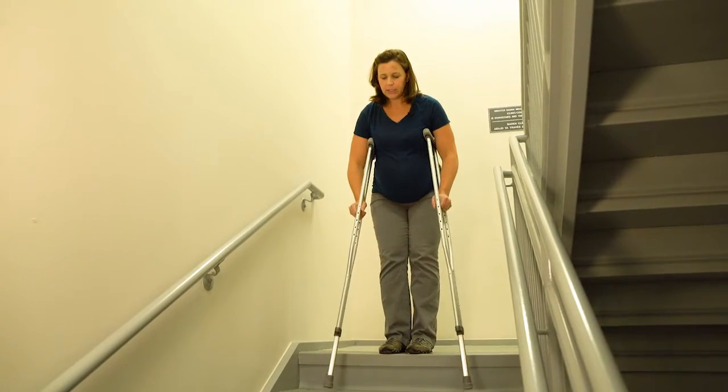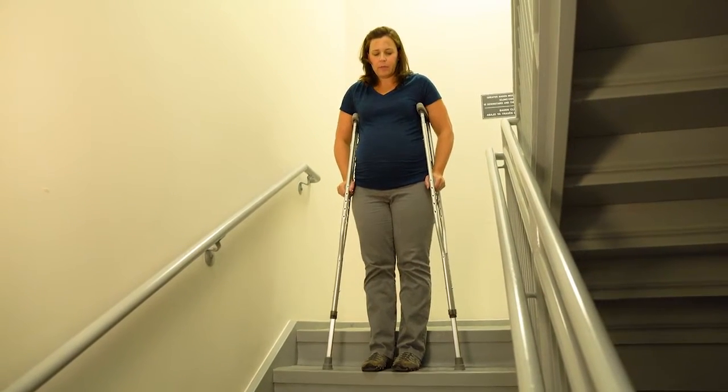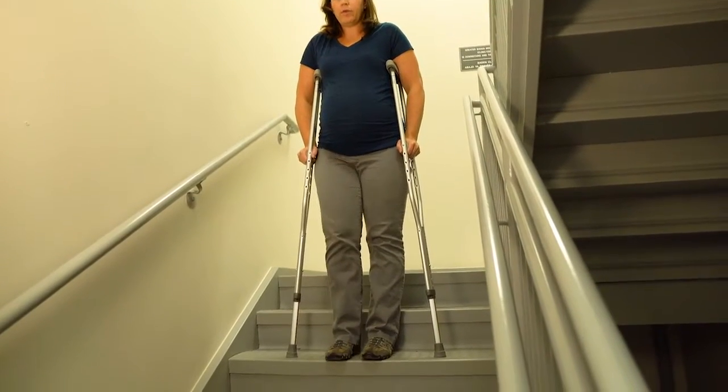When you're going down the stairs, you want to step down with your affected leg first. You're going to put the crutches, your affected leg, and then follow with your good leg.